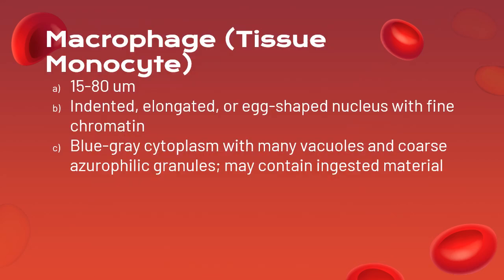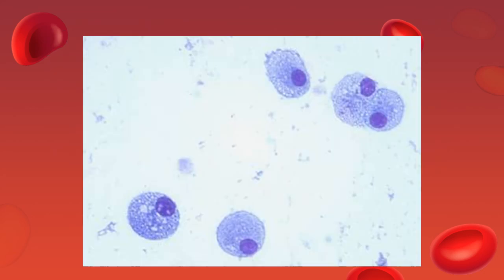Macrophage or tissue monocyte. So, ayun, once na pumunta na siya sa tissues, macrophage na ang kanyang pangalan. So, that's your macrophages.